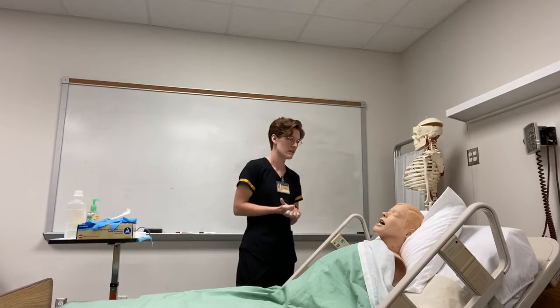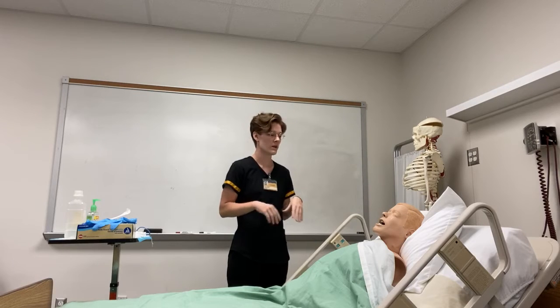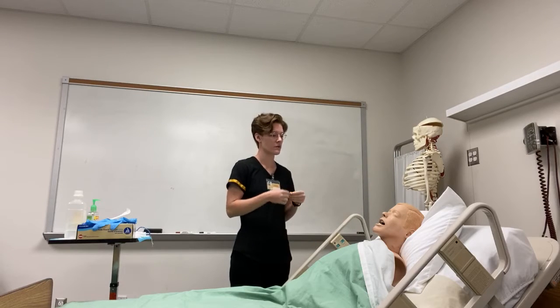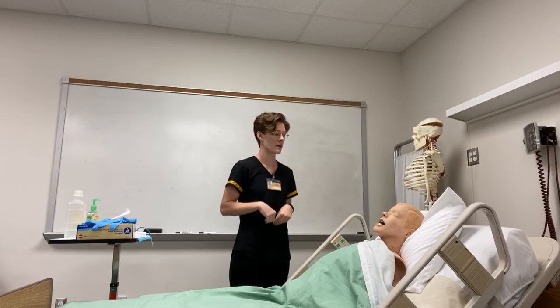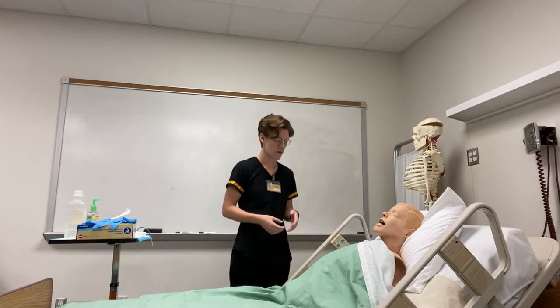Alright, hi, my name is Haley. I'm your student nurse today from the University of Southern Mississippi. I'm going to be inserting an NG tube. So basically what this is going to do, it's going to go through your nose, down your throat, into your stomach, and it's going to be used to get you nutrients and the medications that you need.